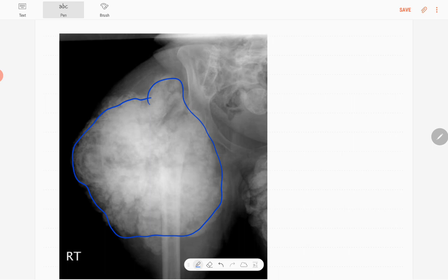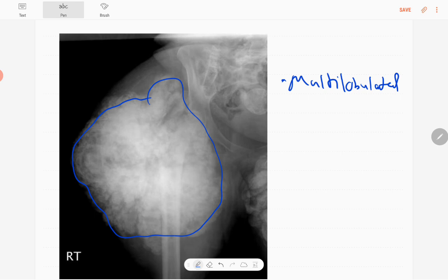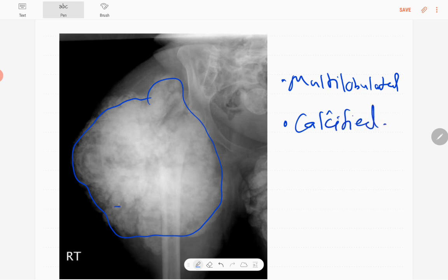It's a large mass with a lobulated outline — multi-lobulated — in the region of the right hip joint. The densities are greater than bone, so these are most likely calcified densities. There are also some levels within the densities, which we call fluid calcium levels.